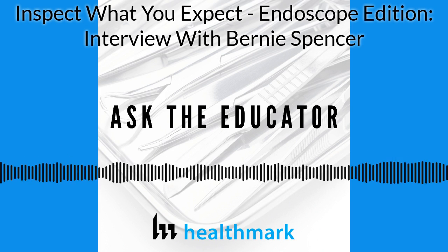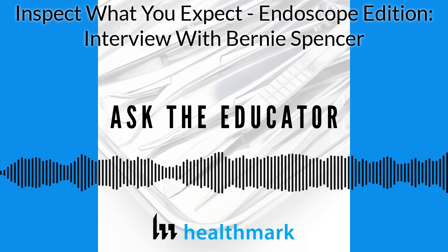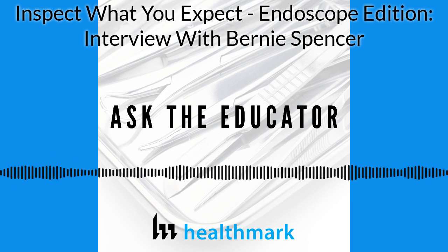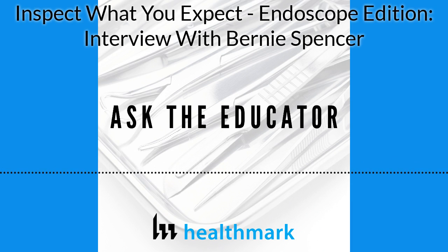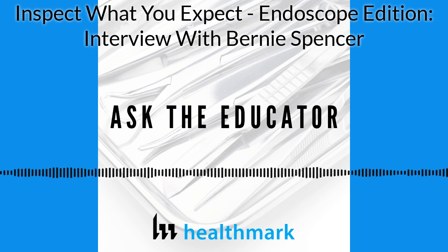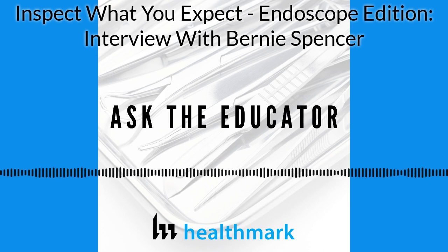And the literature that I read at that time also suggested that there were cleanliness tests that could be used to verify if the channel was adequately cleaned after brushing. So given that information, I had to know for myself. I thought that the cleanliness testing could be another way to inspect what I expect. I expected that channel would be adequately clean after following the IFU, but was it? Before reading the literature, I didn't know these tests existed. So to reach the desired outcome of having that channel adequately cleaned, I was doing my best with what I knew to do. So we purchased 2 different types of cleanliness tests.